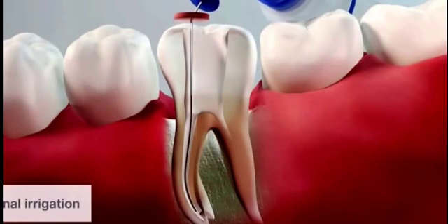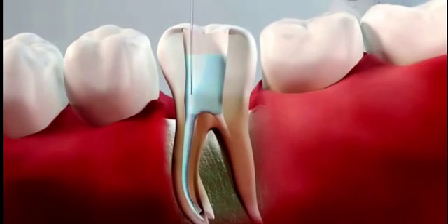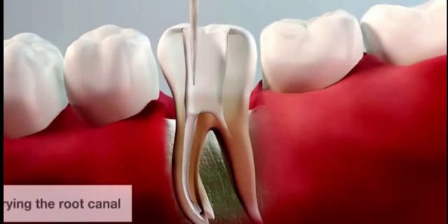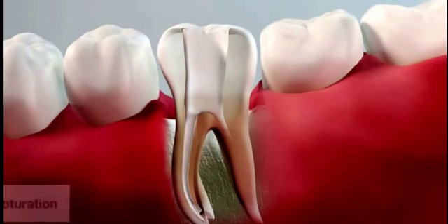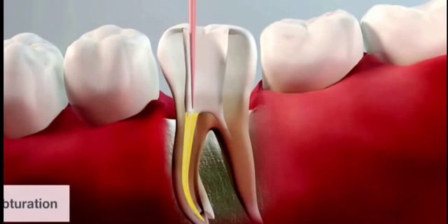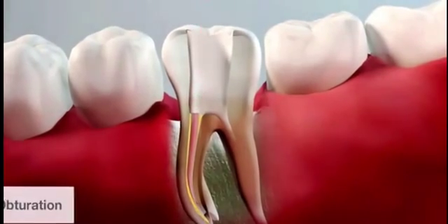When preparation is complete, irrigate the canal and dry it with a reciproc paper point. The root canal can then be filled. The shape of the root canal which has been achieved is optimal for obturation with both cold and warm techniques.